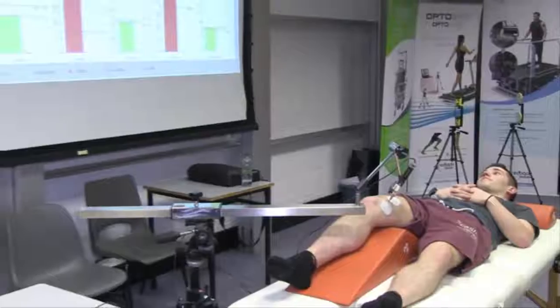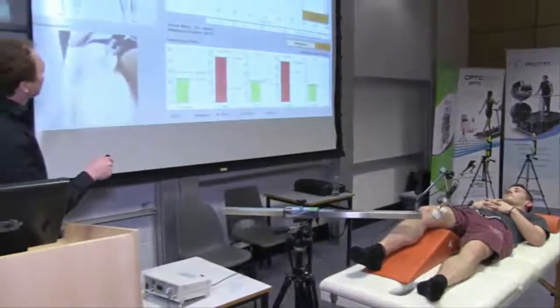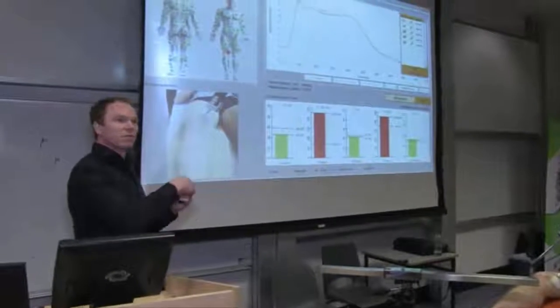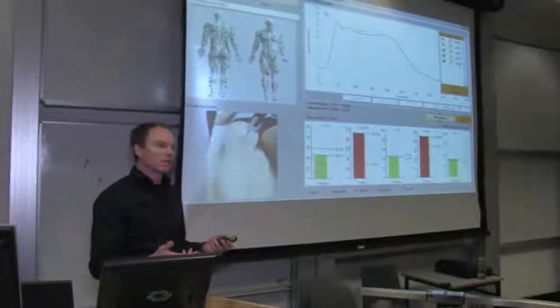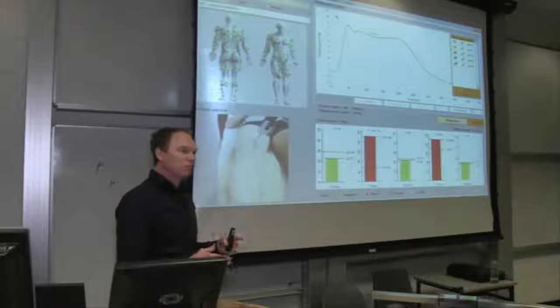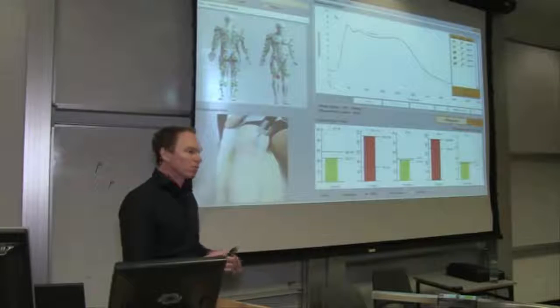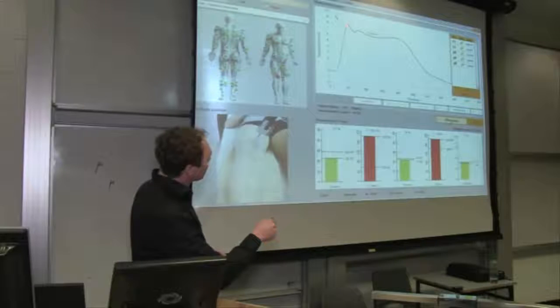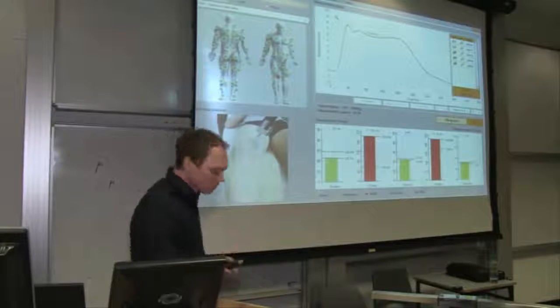So what you're looking at, you don't want to see any changes up to here. If you see some changes later on, these are those parameters that we already discussed, the relaxation time, sustain time. They are not very stable, and also they're not very important. What I'm looking for is to see up to maximum response. I want to see it stable.